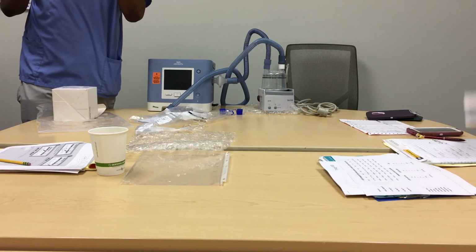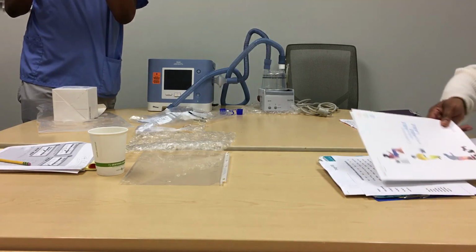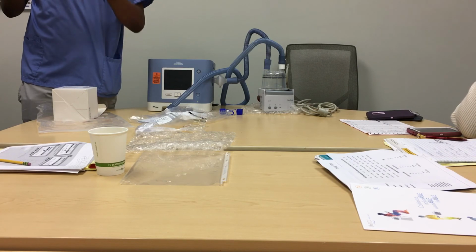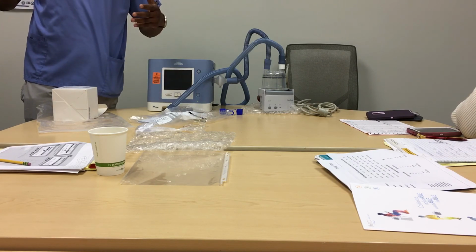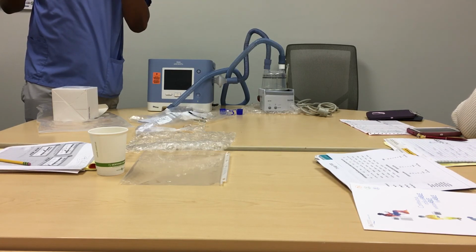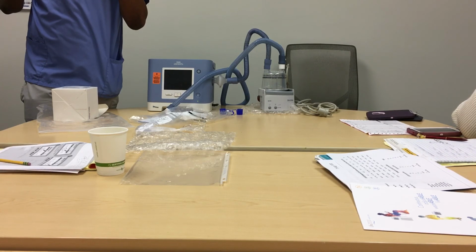Due to that interface, it regulates the flow of the source. When it senses you need more, it gives you a lot more. I know, that's why I said I get the premise of it, but the patient that I put it on, the driving PSI on that patient wouldn't have allowed him to go outside for 4 hours because his demand was so high. So for patients that have the higher demand, there would be a limit. That's why we have to be careful about that, because it's not going to do what it says.